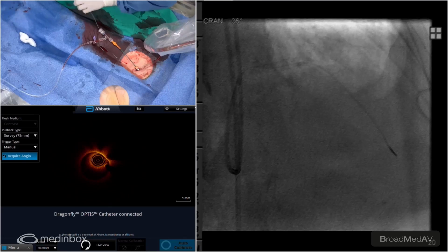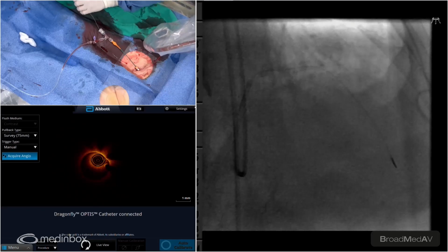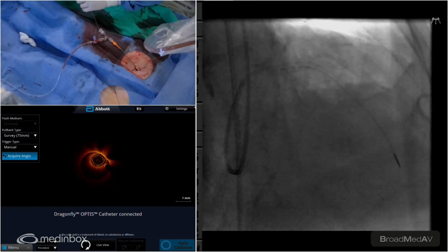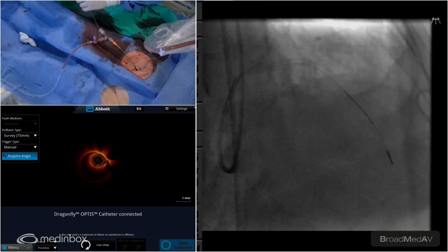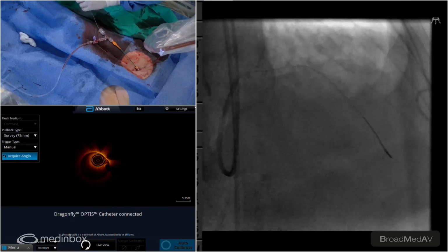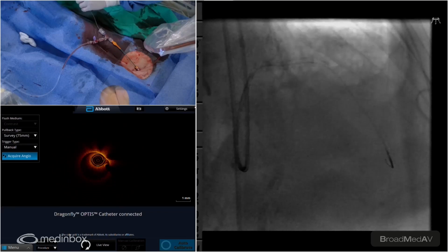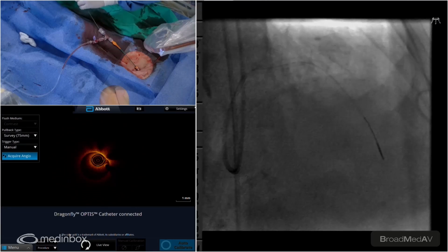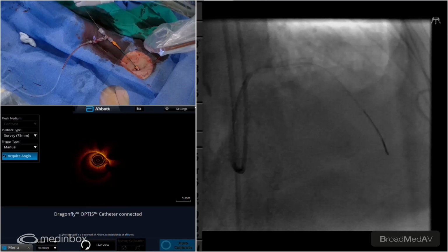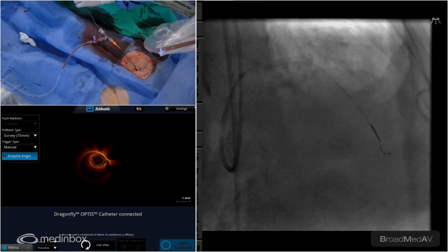I think mostly with aorto-ostial lesions, when you want to rotablate, those are the ones where you definitely need support directing the burr into the vessel. Yeah, I tend to agree with that. We tend to use the floppy for most cases. You can probably get away with a stiff or extra stiff wire in this one as well, but we tend to prefer that for the ostial cases where you really need the support up top.